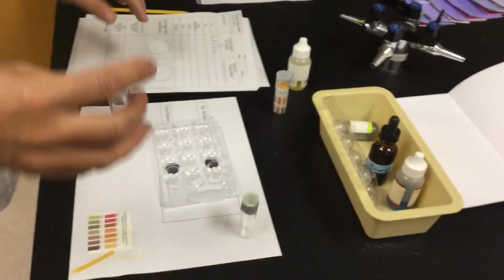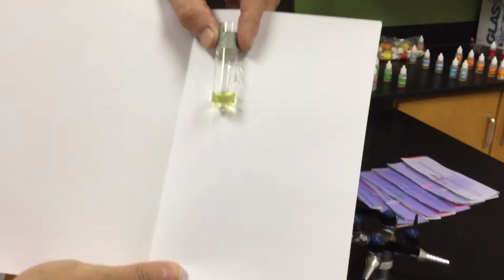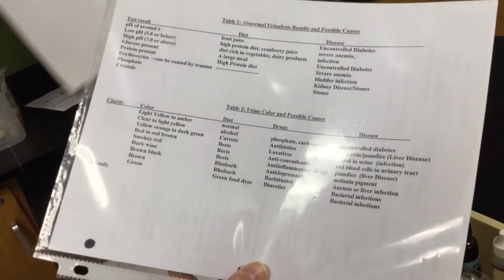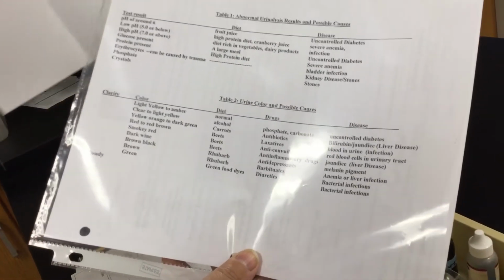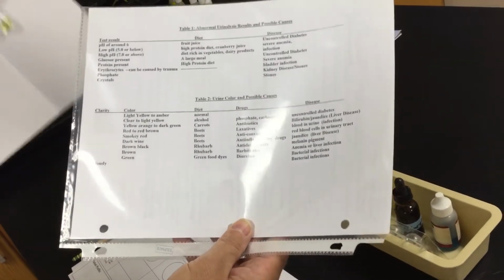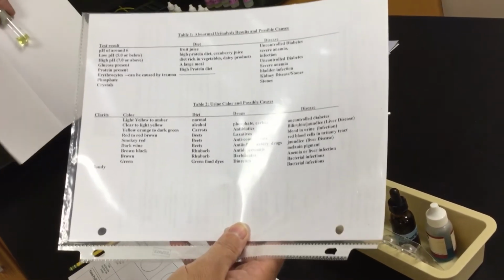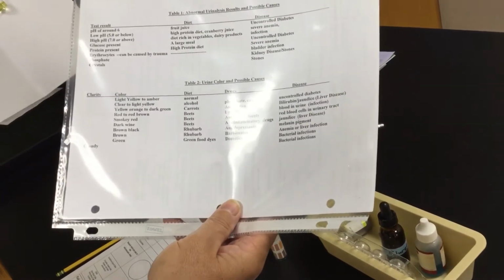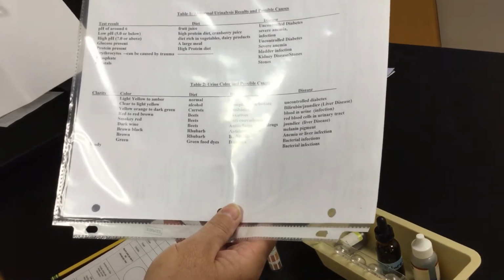So now with this glass tube, we need to look at color. And I say hold it up to something that's white. It's a little easier for you to see. And don't just go yellow. You guys will see a chart that goes through a bunch of different colors for you. And it tells you what's going on. So don't just assume, oh, there's color to it, there must be something wrong. Because a lot of the foods that you eat will change the color of your urine. It will change the pH of your urine. It may have more sugar within your urine. So just because you see positive test results for some of these, think about the scenarios that they have, or the situations that these individuals are coming to the doctors and telling the doctor, because there may be a problem and there may not be a problem based on what you have.